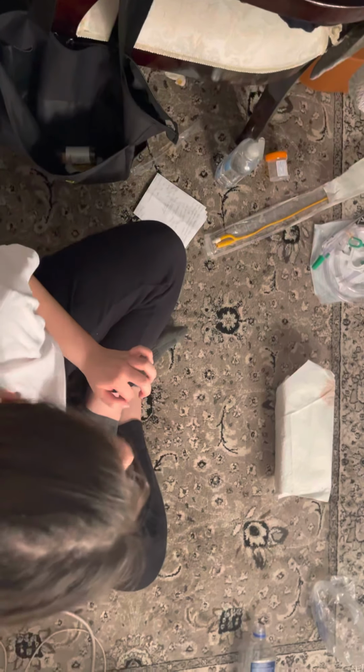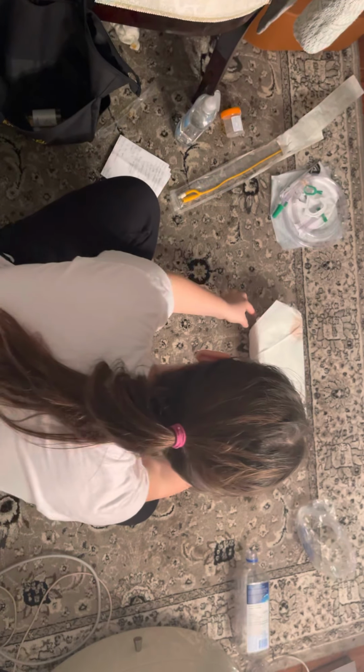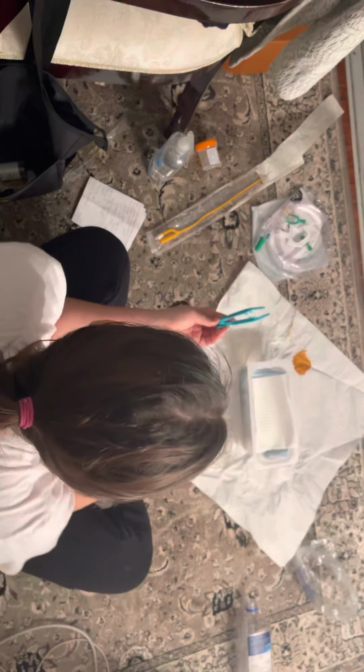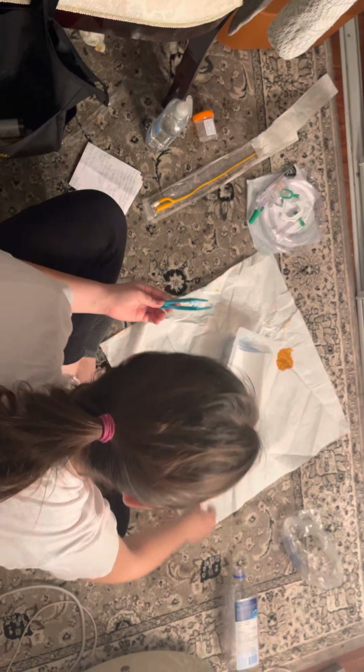And I'm going to begin by opening up my catheter kit. So this is my transferring forceps, touching my 1-inch border to keep sterility.